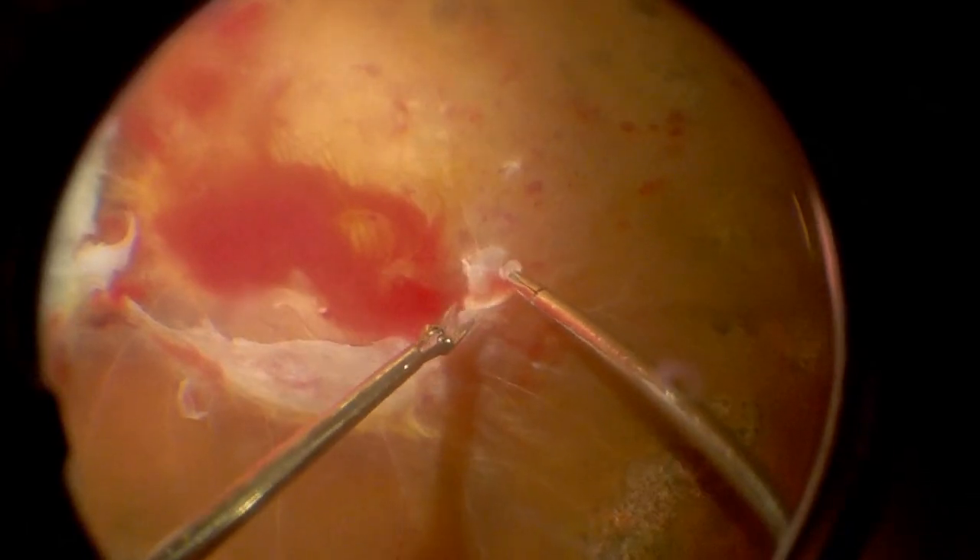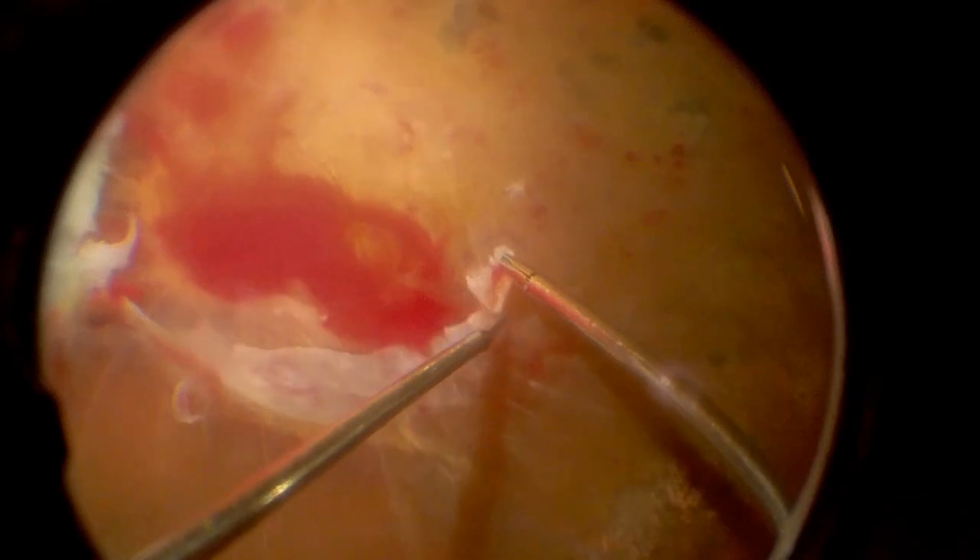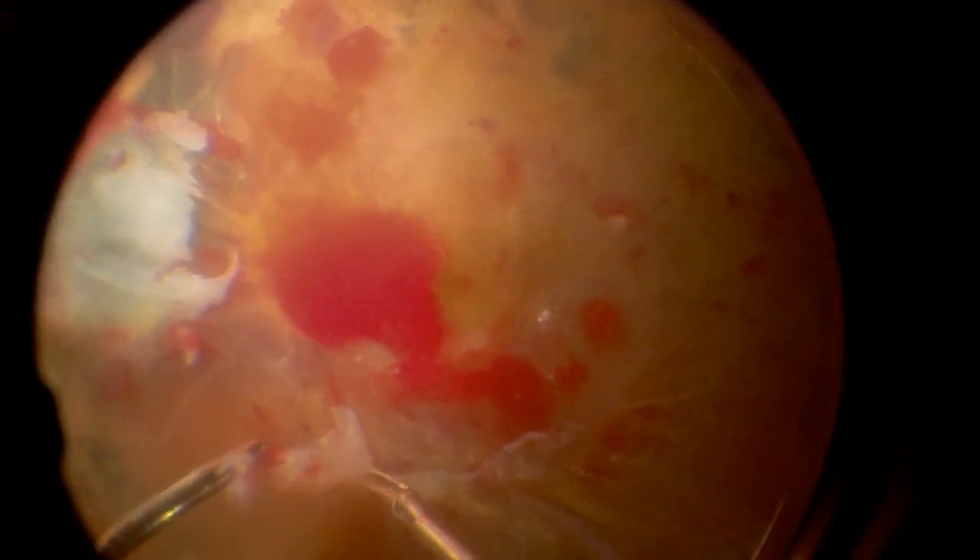Segmentation and illumination is very efficient using the chandelier, and the amount of light delivered inside the eye is bright enough to allow for excellent visualization. In this case, for example, I'm only using 70% of the light but I can visualize clearly those membranes, even with the intraoperative bleeding.